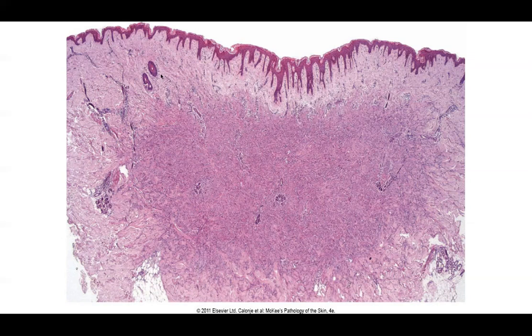Even just seeing this acanthotic epidermis, with just a sliver of fibrohistiocytic proliferation, you can say it looks like a superficially sampled dermatofibroma. So for all of the clinicians out there, I would recommend doing a punch biopsy into an area that you think is a dermatofibroma, so we can get a holistic sense of what's going on.